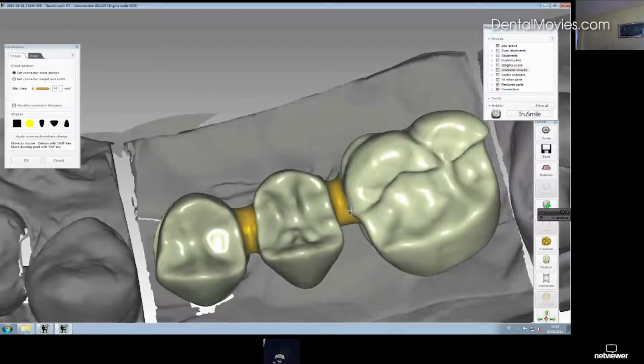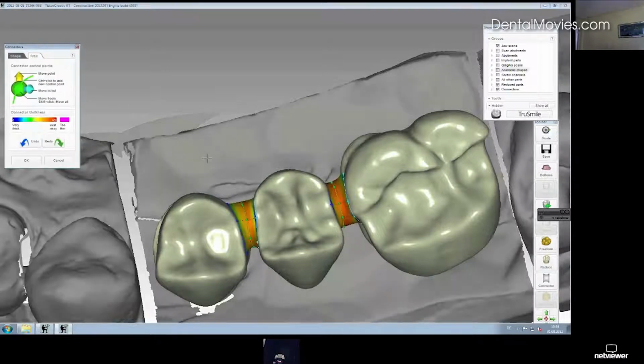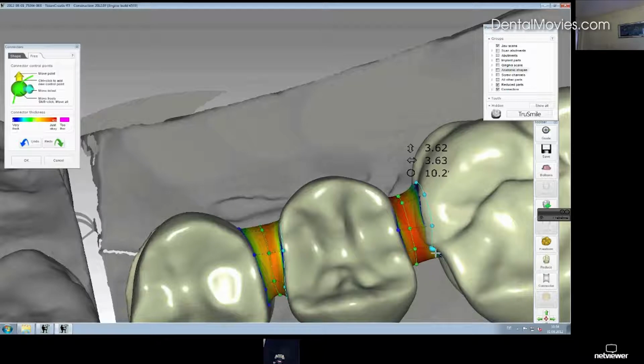And now you can go back to, for example, the crown bottoms, freeform the single tools, or change the connectors, for example. And every step we did in the construction we can change here. Here, for example, the connectors.